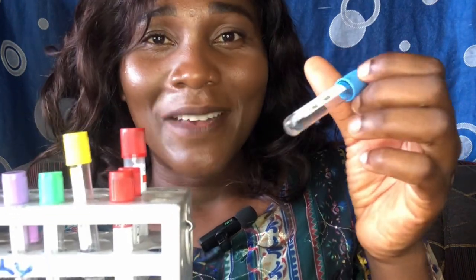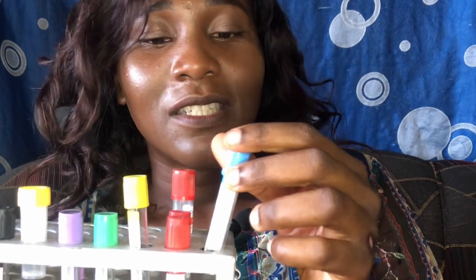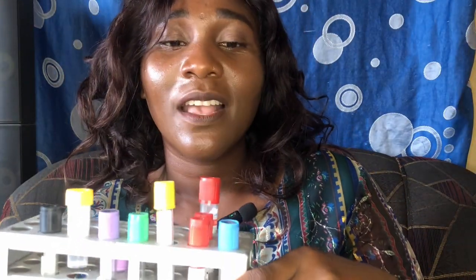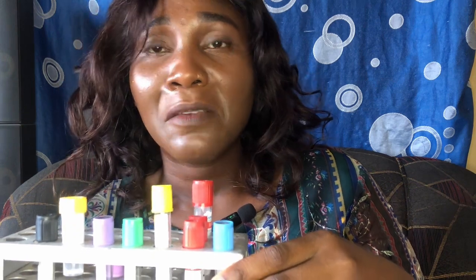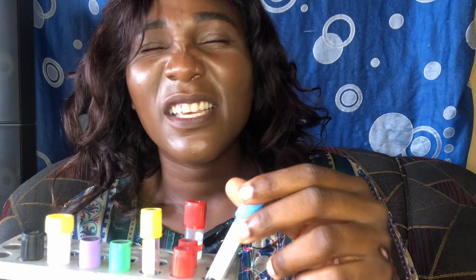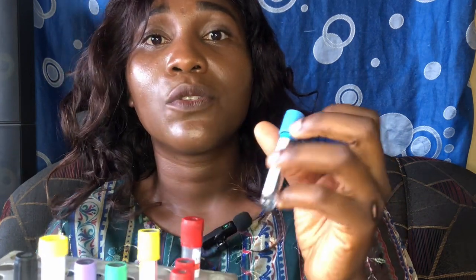This is a light blue top tube. What comes to your mind when I show you this? When you get to the phlebotomy unit and you're asked to run a PT test, that's prothrombin time, or APTT, or fibrinogen, or just coagulation studies, the tube to use is this light blue top tube.